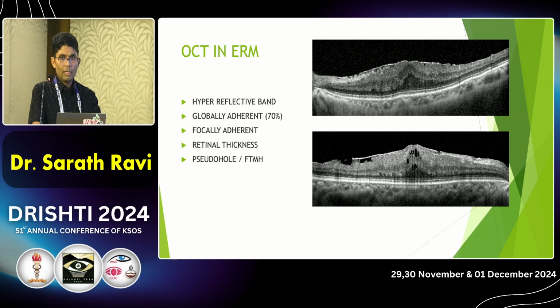OCT helps in the assessment of these patients with epiretinal membrane because it's seen as a hyperreflective band. You can see the amount of adherence to the underlying retina, which could be a globally adherent membrane or it could be focally adherent.